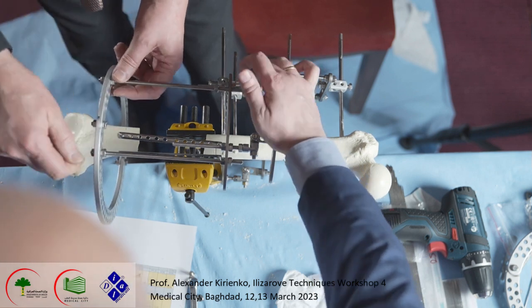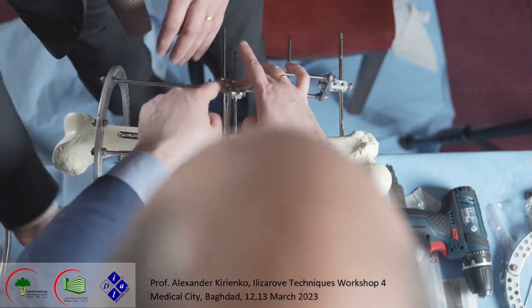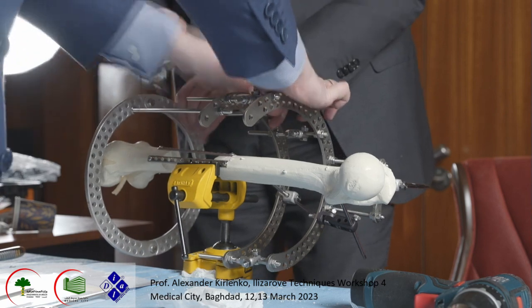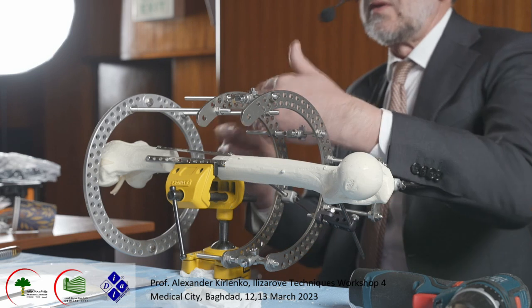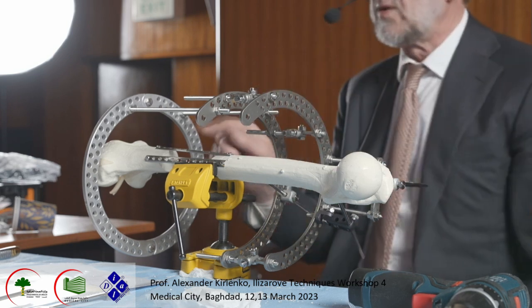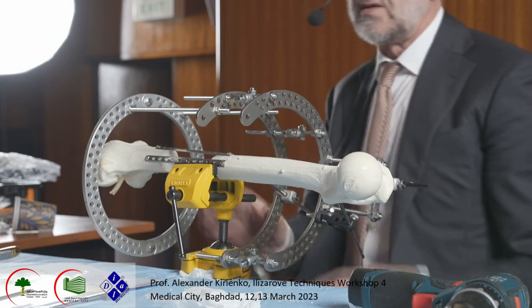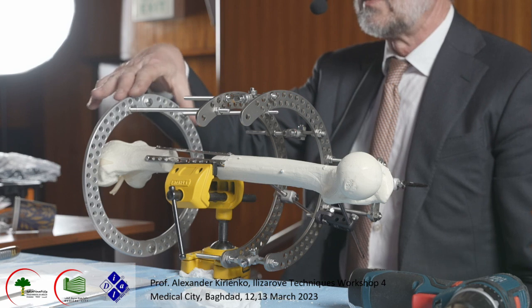Okay, you should center your ring on the distal part of the femur, because if it is displaced or maybe not realigned well, you should adjust it with an oblique rod or some plate, because we have a different plate and we may adjust it. Like I said before, this ring may be a little bit smaller.